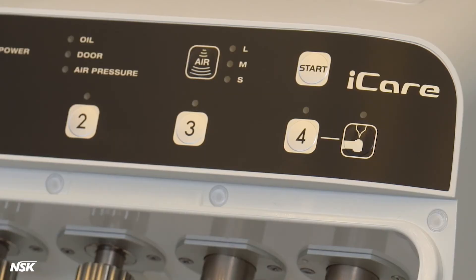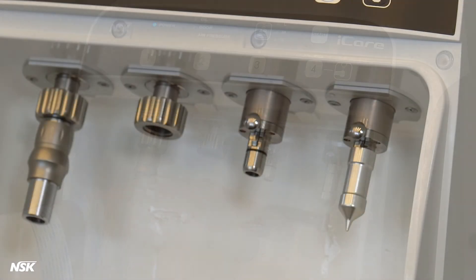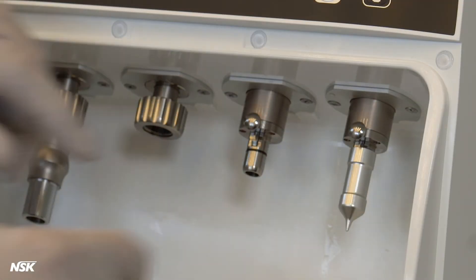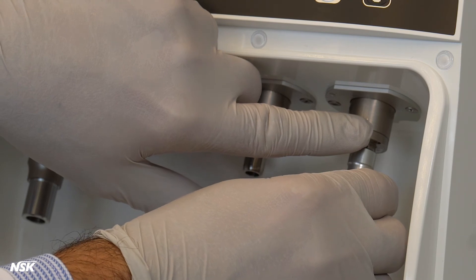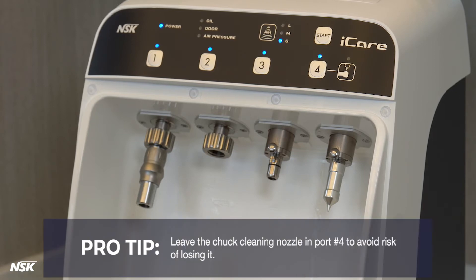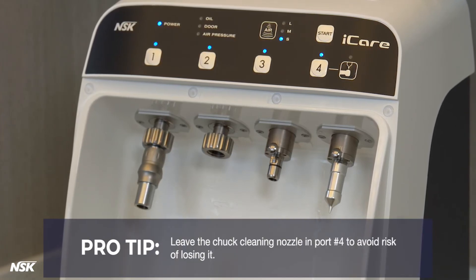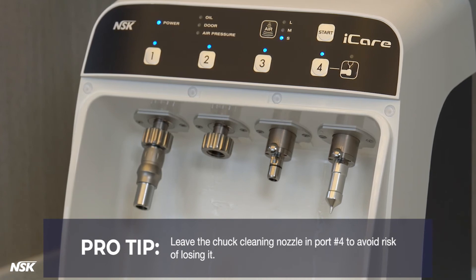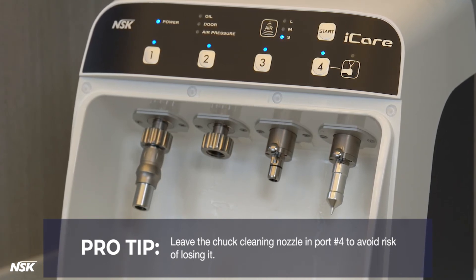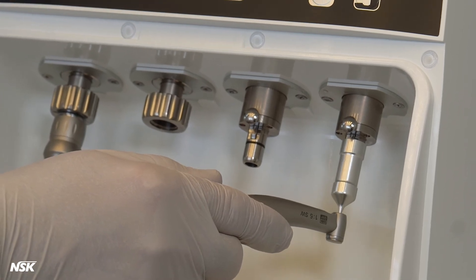The light will blink during the lubricating process. When lubricating is complete, you will hear a short beep and the light will turn off. To remove the chuck cleaning nozzle, push the lock button and pull down the nozzle gently. You can store it in the top compartment for future use. Pro tip: it is recommended to leave the chuck cleaning nozzle in port number four to avoid the risk of losing it or missing the chuck cleaning. It also keeps the cleaning process top of mind. It is recommended to perform chuck cleaning several times per week.